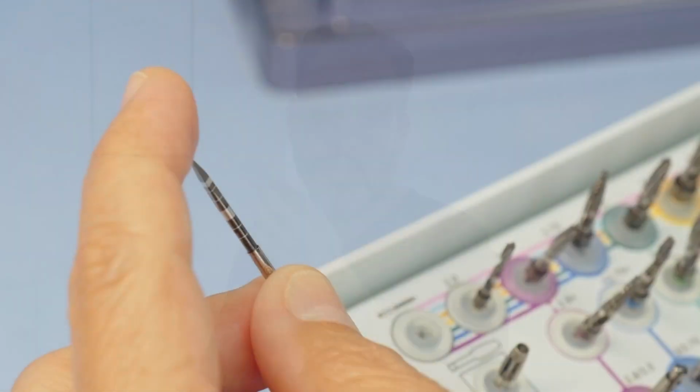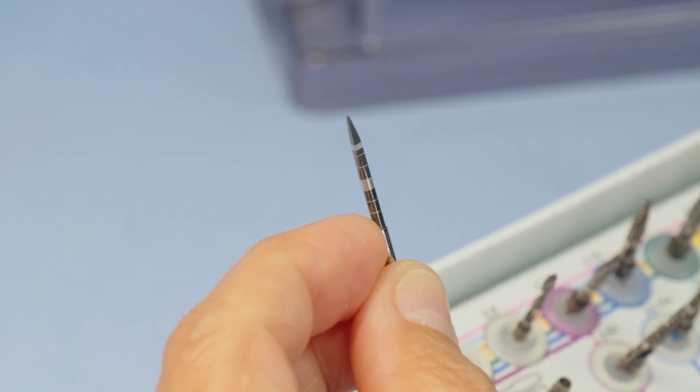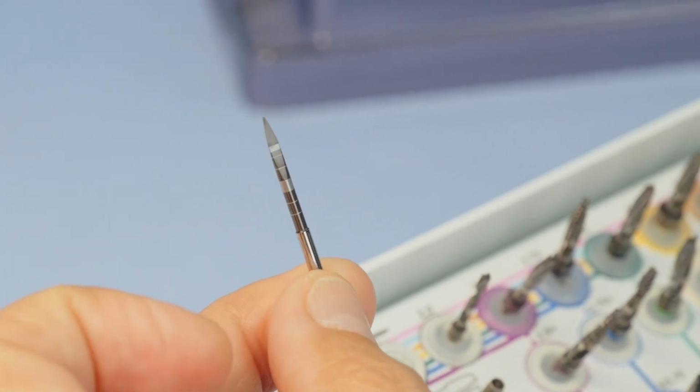When I'm teaching younger dentists how to do this, and I continue doing this every single day, even though I've been doing it for many, many years, I like creating for my single implant sites something called the bleeding point. And I perform that bleeding point with the lancet drill, which is the thinnest and sharpest drill that you're going to have in your surgical kit. If you're using a guided surgical protocol, you can go through the guide and just create a little dimple, or a stab, in the tissue, and then go maybe 1 to 2 millimeters within the bone. All you're trying to accomplish is creating that bleeding point.